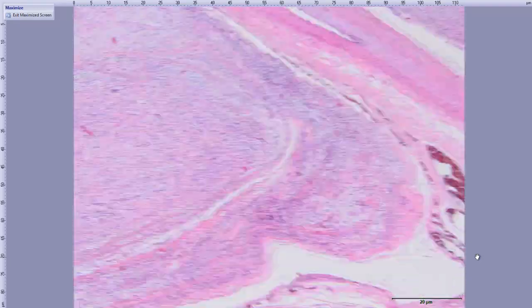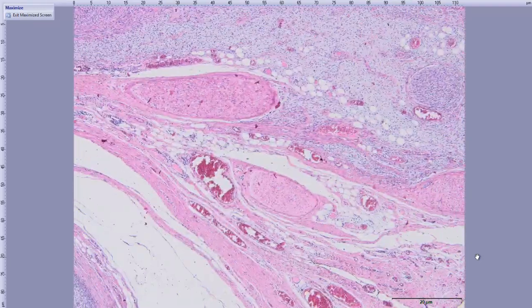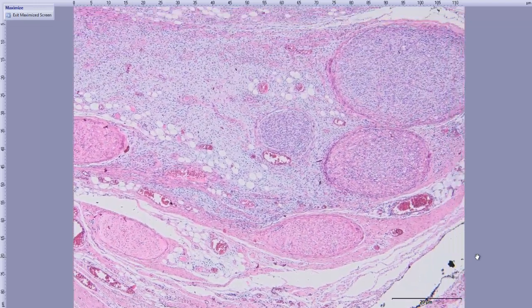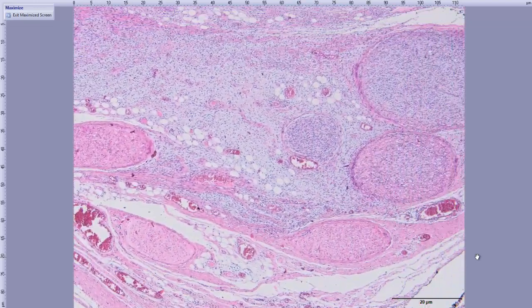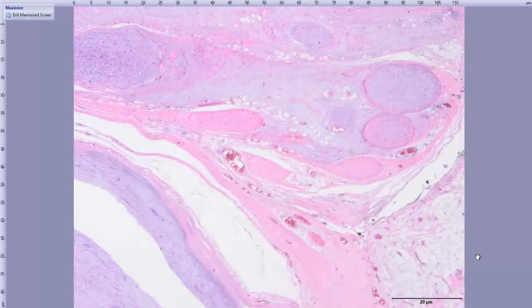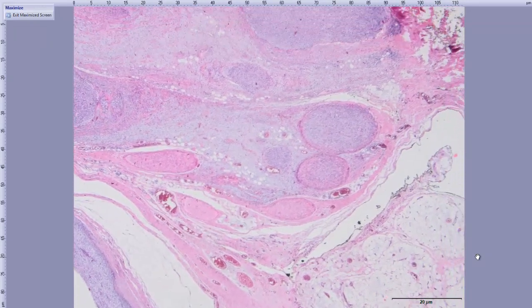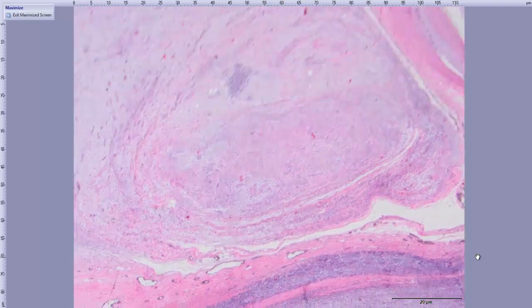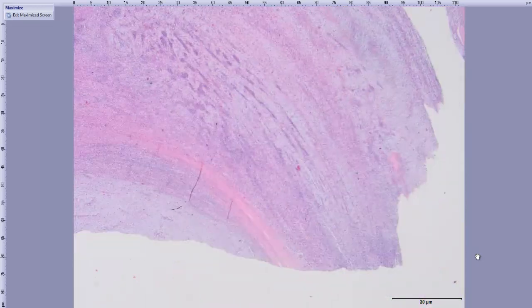this is the second important information about this case, that as we sampled that area, we have found a very nice peripheral nerve relation of this tumor, and I'm going to show you now. This is the origin of the tumor, and it turns like a hippocampus and then it enlarges, and then this is the tumor that we see. So the macroscopic examination is very important in order to reach the correct diagnosis.